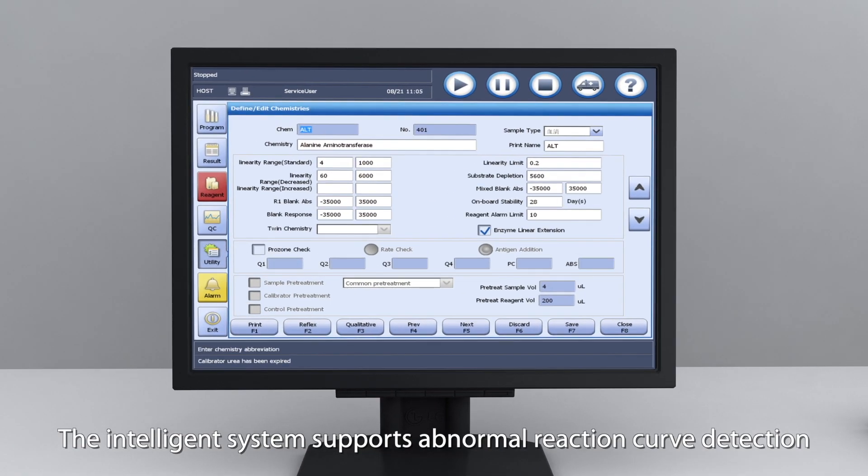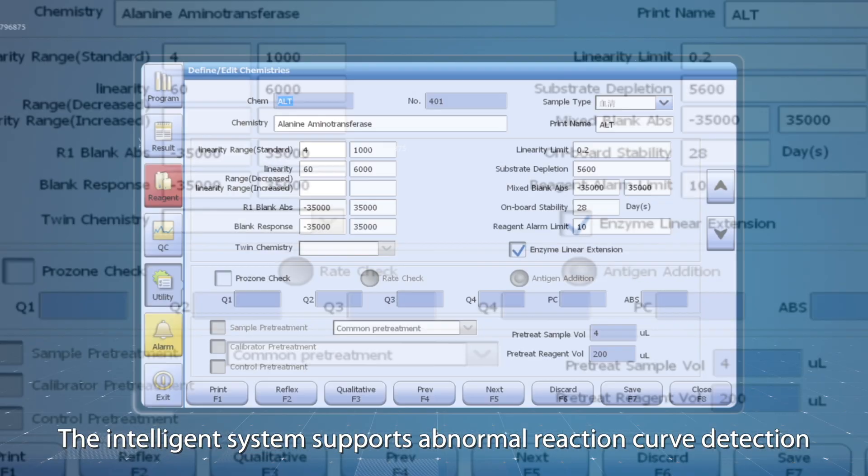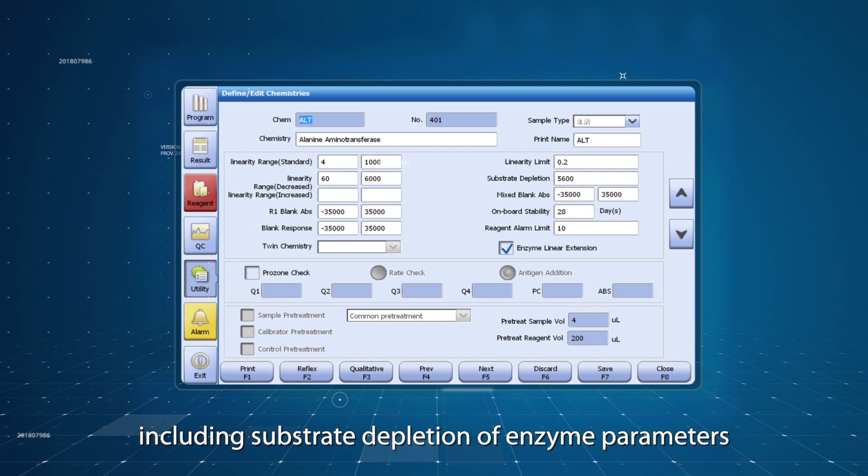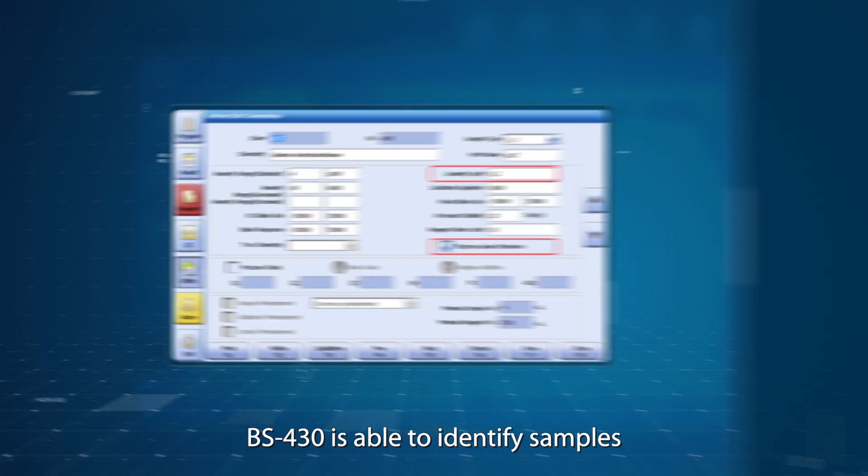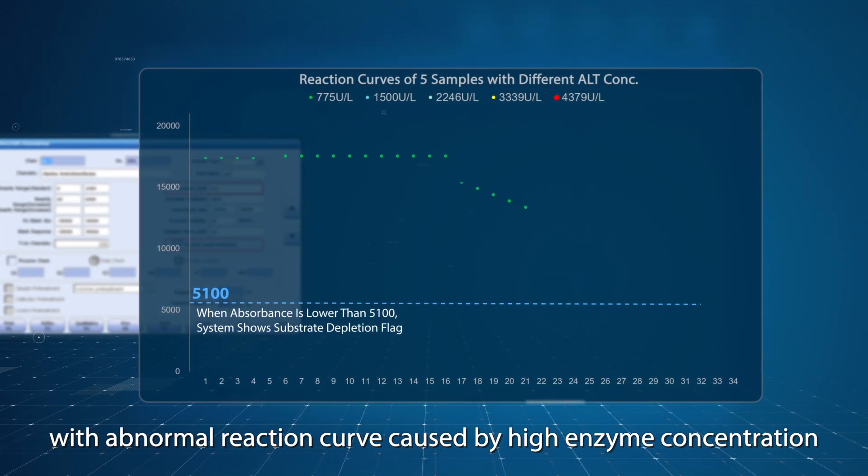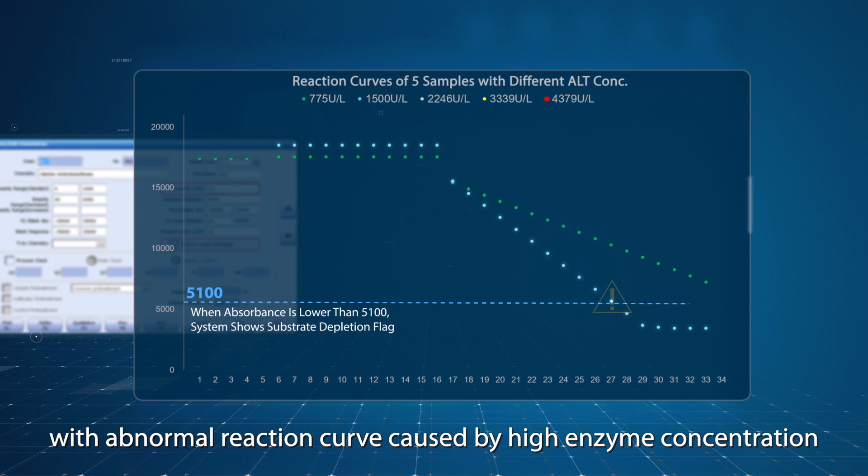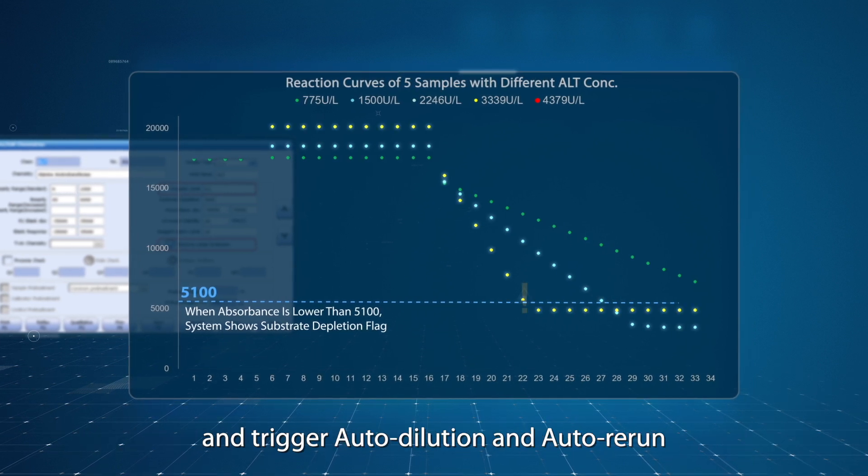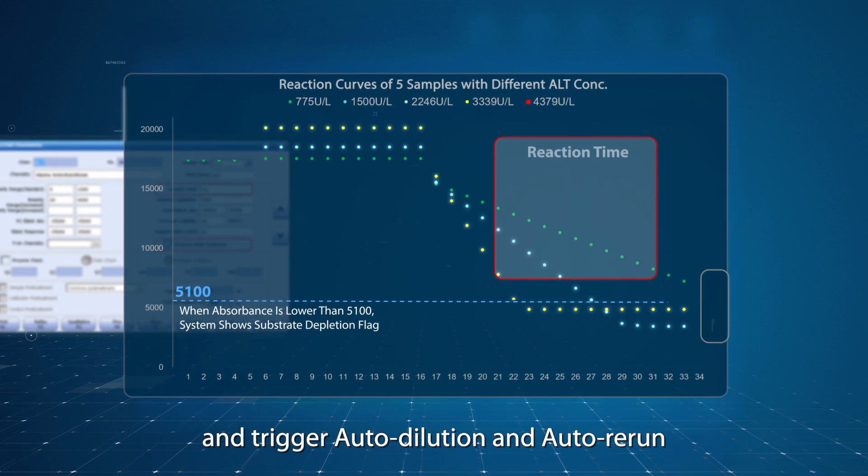The intelligent system supports abnormal reaction curve detection, including substrate depletion of enzyme parameters. BS430 is able to identify samples with abnormal reaction curve caused by high enzyme concentration and trigger auto-dilution and auto-rerun.